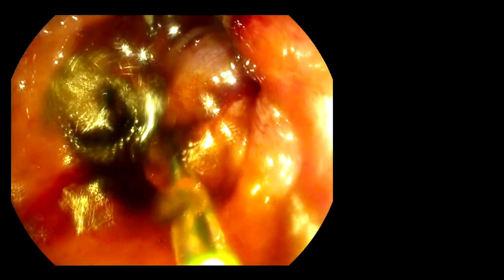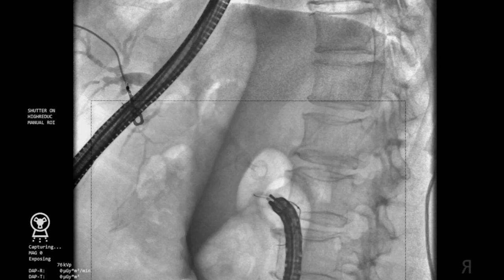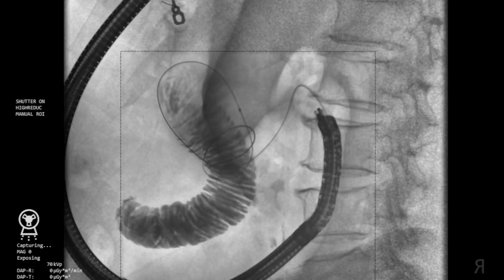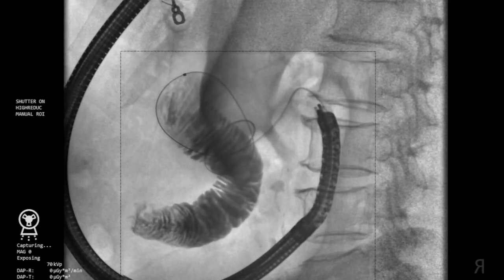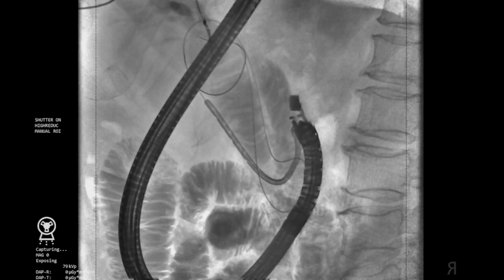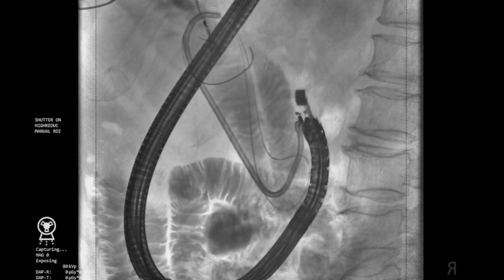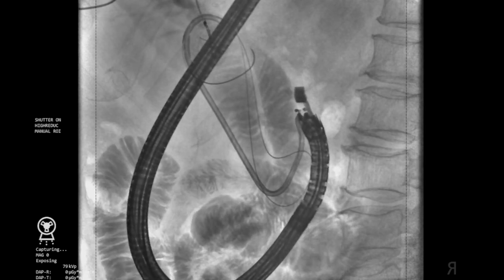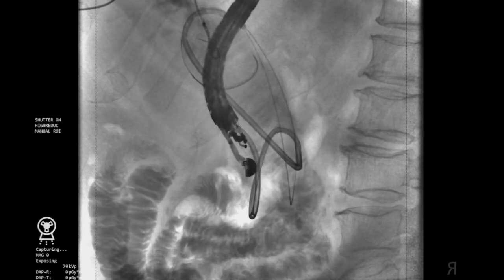A tandem ERCP catheter was first inserted through the duodenal stenosis, which then allowed a 0.025-inch guidewire to be passed into the jejunum. Contrast was injected through the catheter to confirm guidewire placement in the small intestine. The tandem catheter was then removed and a 10-French nasojejunal tube was inserted over the guidewire in order to instill saline mixed with methylene blue and contrast into the jejunum.